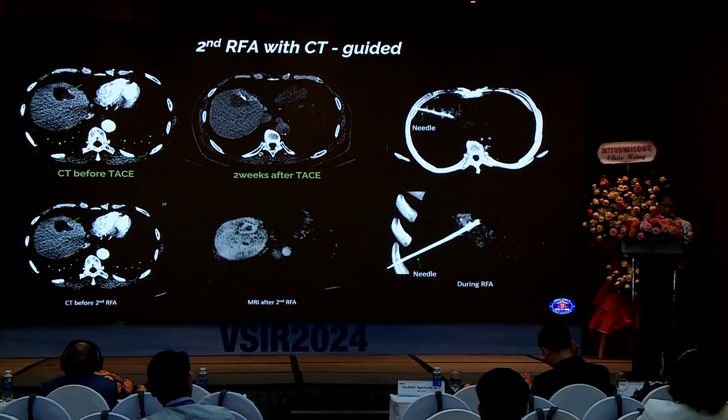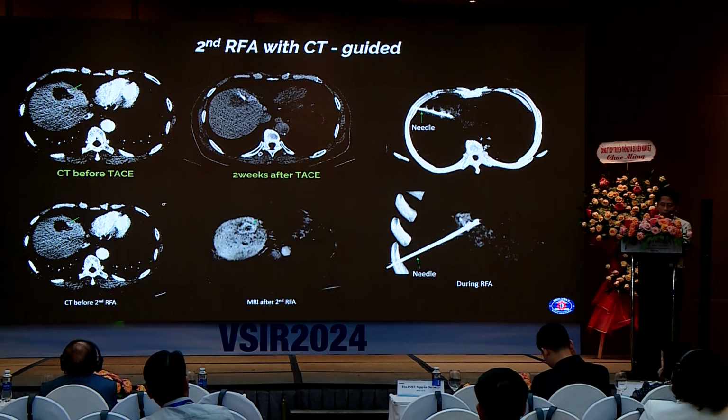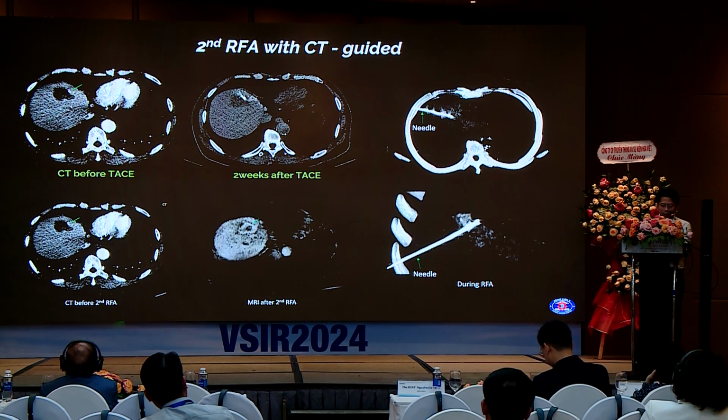This is a CT image 2 weeks after the TACE. With the lipiodol deposition in the target lesion, we can perform the second ablation with CT guidance, and the lesion has complete response. This is the MRI image after the second ablation.